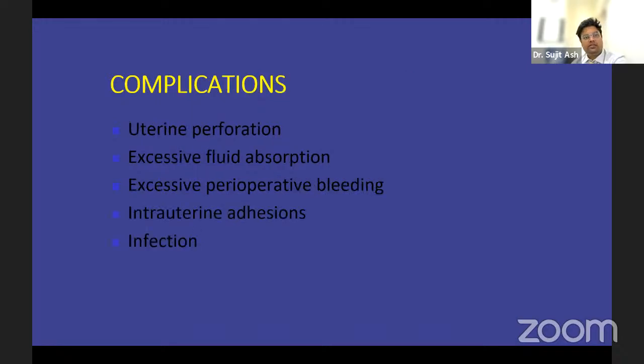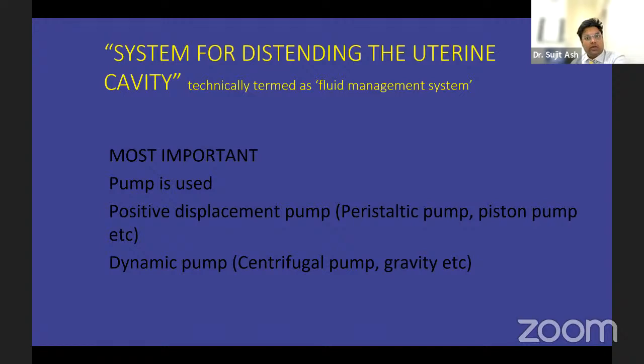Complications, as in any other hysteroscopic procedure, you might land up with perforation or excessive fluid absorption. What you need to remember is that the fluid management system is very important. You can use different kinds of things. Either you use gravity to distend the cavity.